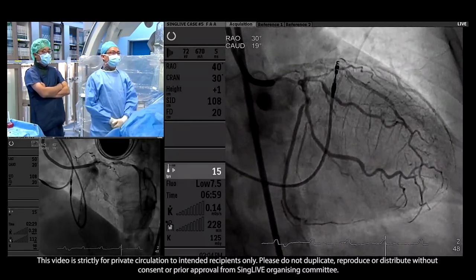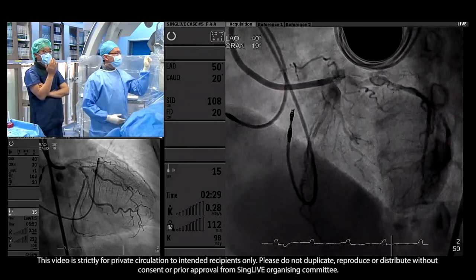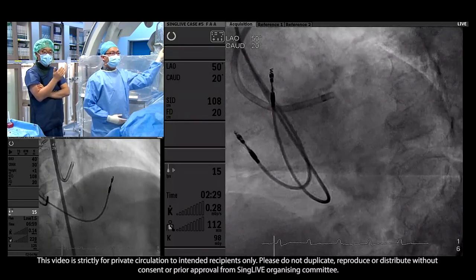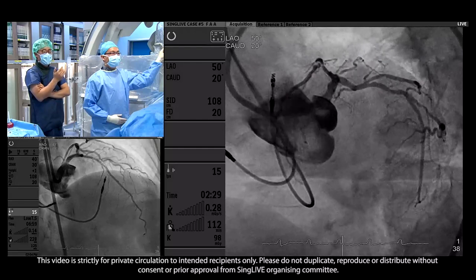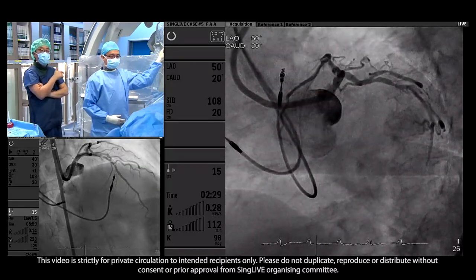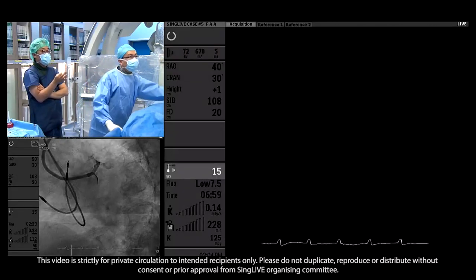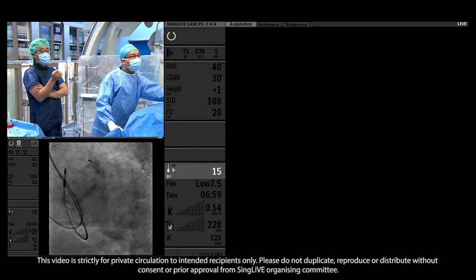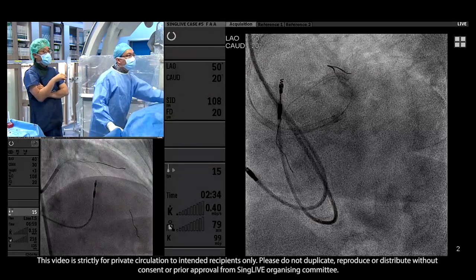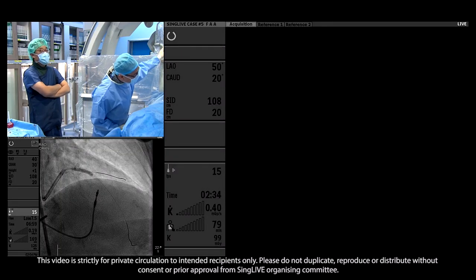So, I'm D.W. Park from Asan Medical Center. As everybody knows well, this patient is the typical example of the CHIP patient, the complex high-risk indicated PCI. This patient is an 86-year-old female with anatomically very complex distal left main disease. The main problem was that she has a low ejection fraction, 35%, and there are diverse risk factors for such patients.